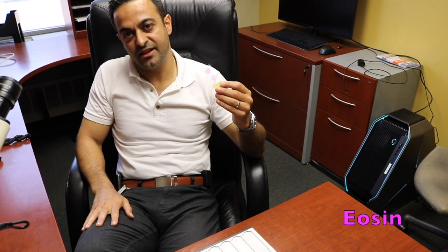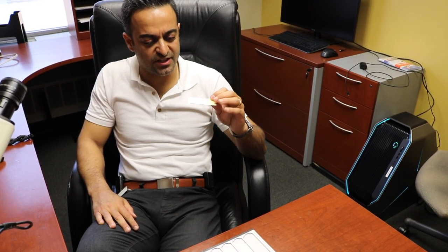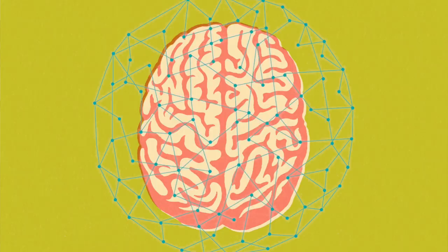Hematoxylin, which is a purple dye as we'll see, stains nuclei, whereas the pink that makes up the majority of the slide is the eosin staining the cytoplasm and the processes of our neuronal cells. To give you an estimate, the volume of this tissue is probably 1 or 2 millionth the whole volume of the brain. So we'll see how much detail we can resolve by looking at a very small portion of the brain. Today's goal is to look at the cerebral cortex.